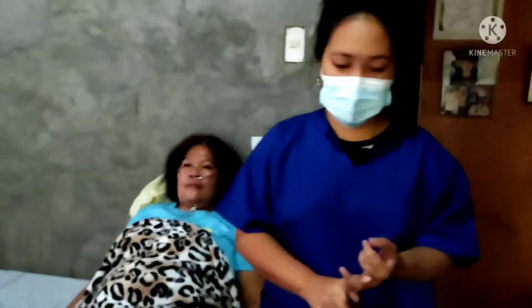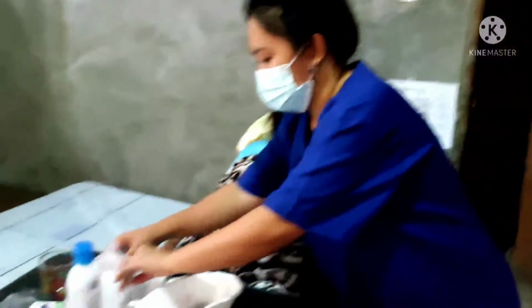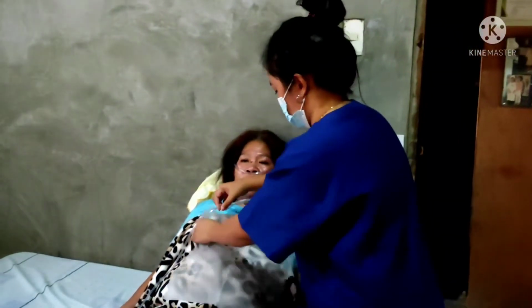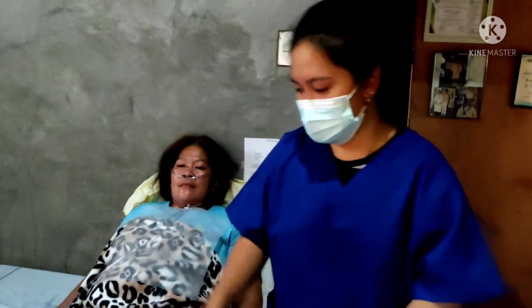Assess for signs the patient may require suctioning, such as gurgling, drooling, gastric secretion, vomiting, unrelieved coughing. Drape her neck and chest. Put on the gloves and use a mask, gown, and face shield.